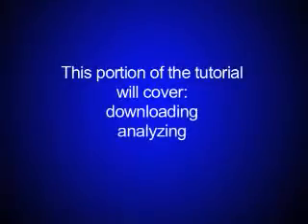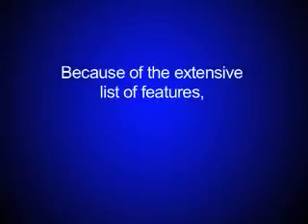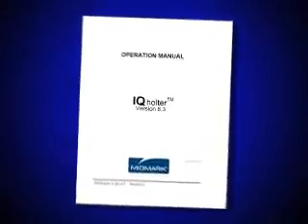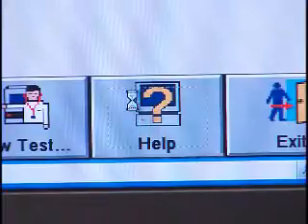This portion of the tutorial will cover downloading, analyzing, and editing a Holter scan. Because of the extensive list of Holter features and the flexibility of the program, not every function is described in the tutorial. For an in-depth explanation of the features and functionalities of the IQholter, please refer to your operation manual or the help menu of the software.